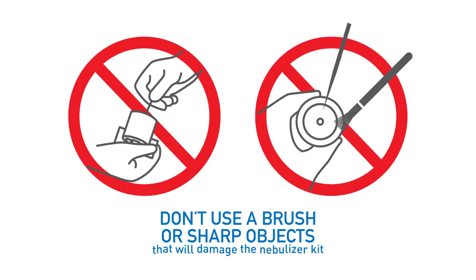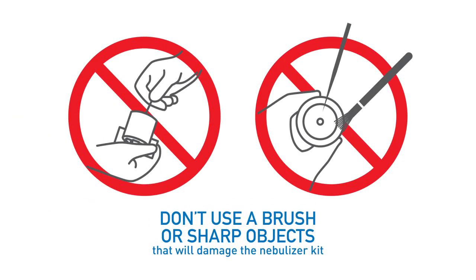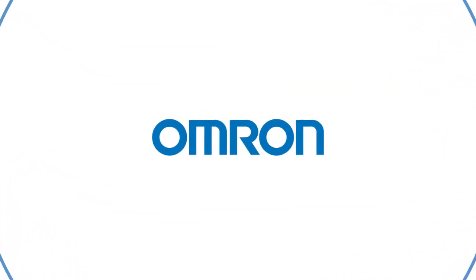Don't use a brush or sharp objects because that will damage the nebulizer kit. Stay clean. Stay healthy. Contact us today for more information on Omron nebulizers.